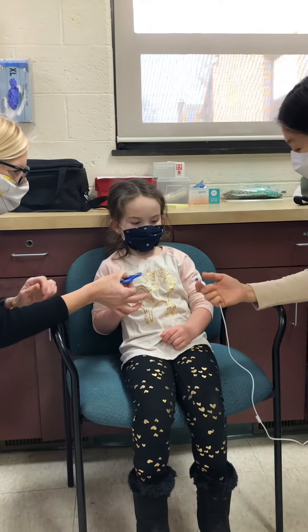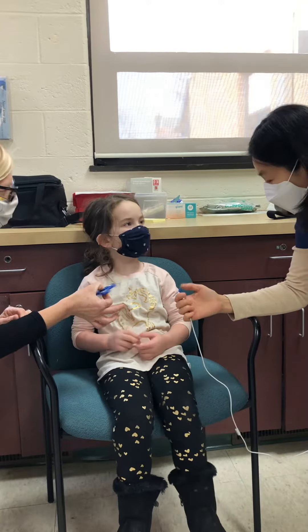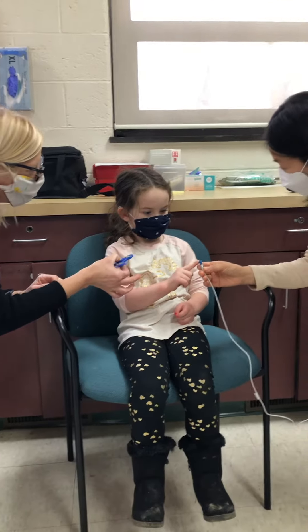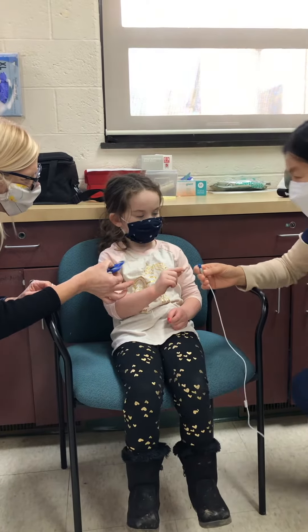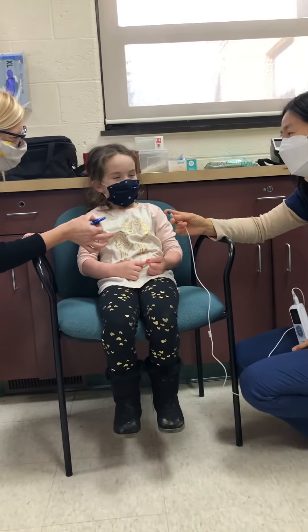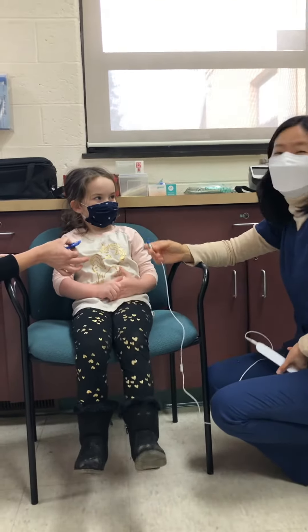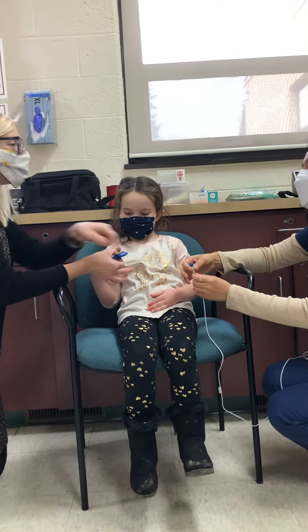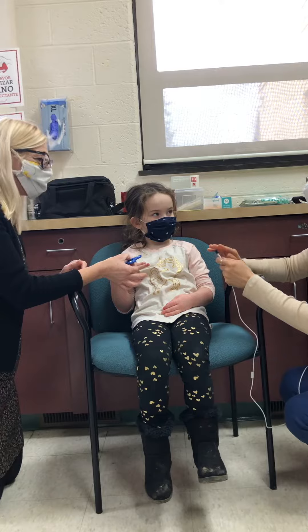Selena, do you want to touch this one? Do you want to feel this first? Do you want to touch it? How does it feel? Is it sharp or soft? Hard. Hard? It's okay — it's hard on the top and soft on the side. Yeah, it's very, very soft.